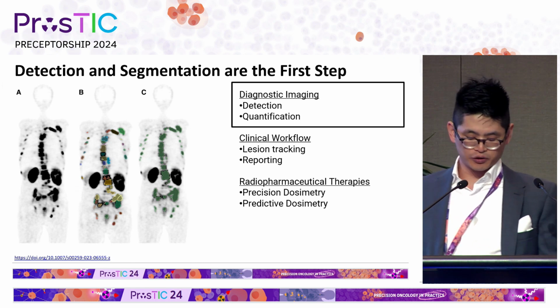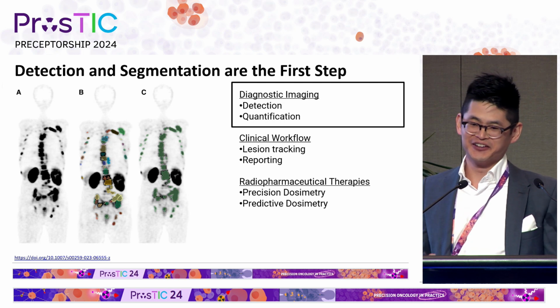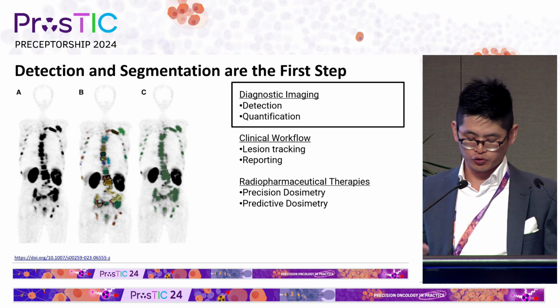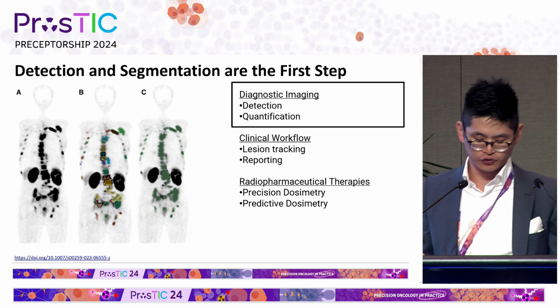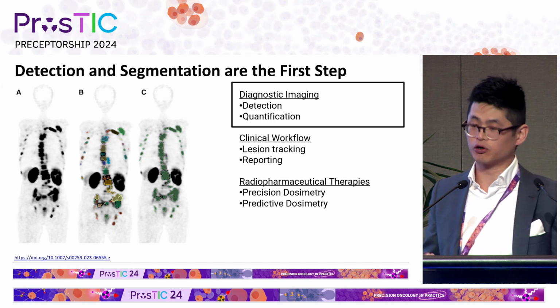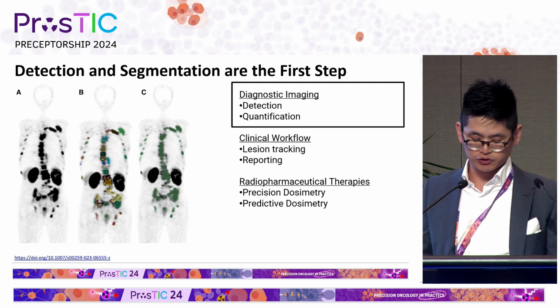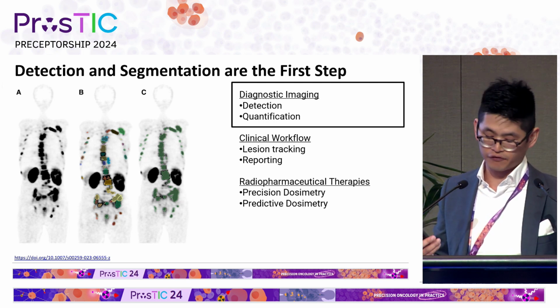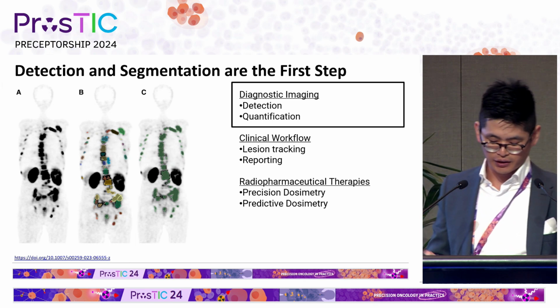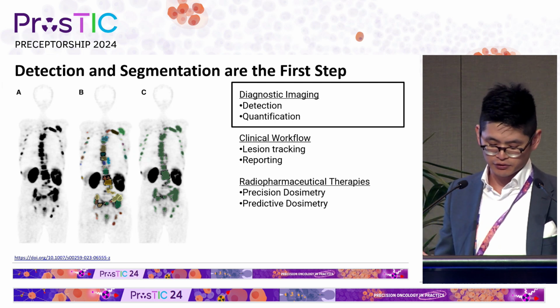In PET, we're really trying to answer the question, is it hot or not? And then, is it disease? So segmentation is also then about drawing a line around the tumor and answering where is the border of the tumor. And segmentation can be done with absolute or relative thresholds or completely manually contoured. At Peter Mac, with the PSMA PET CTs, we use an absolute threshold of 3 for our contouring. And in this example study, they did actually manually contour by imaging experts as the ground truth. So already there's a difference.